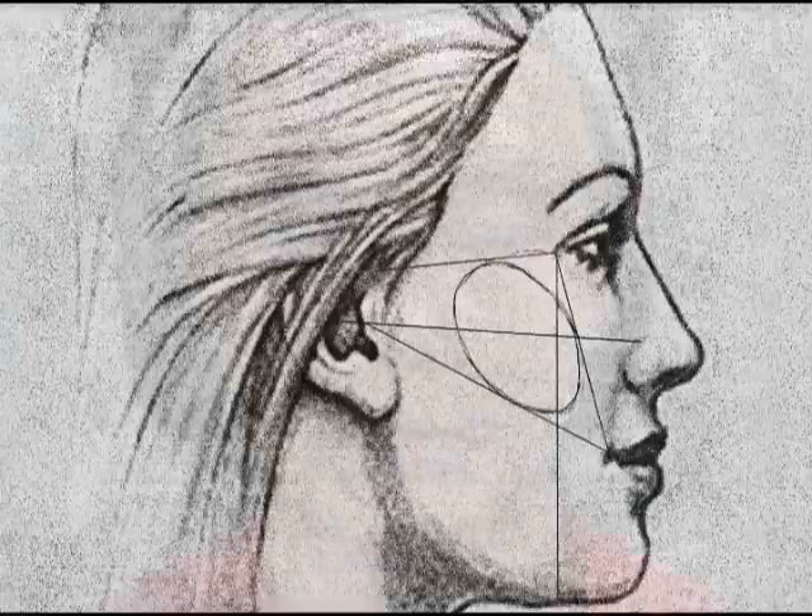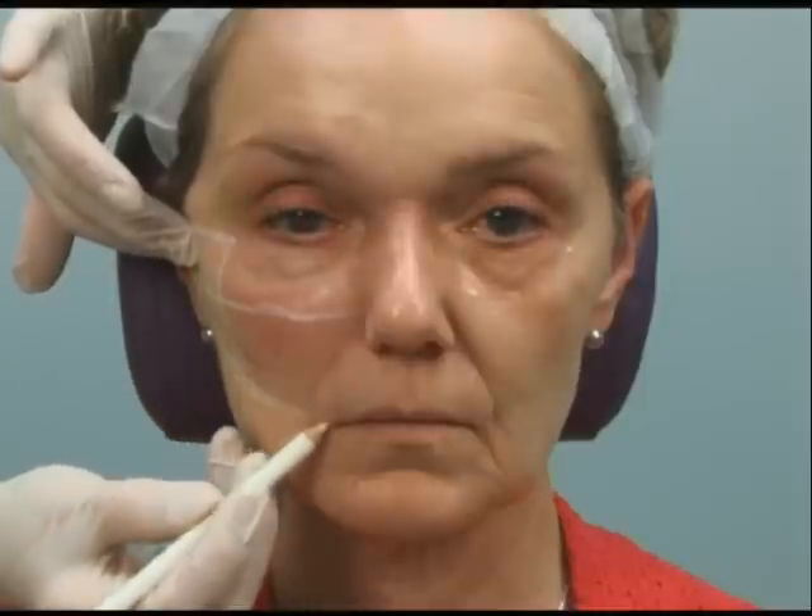I'll just use a white eyeliner so that it doesn't tattoo the patient. We'll go from the lateral canthus to the top of the tragus, and then a perpendicular line down from that. Go from the middle of the tragus to the top of the alar crease, then from the middle of the tragus down to the commissure. I usually add a little line from the lateral canthus down to the commissure.